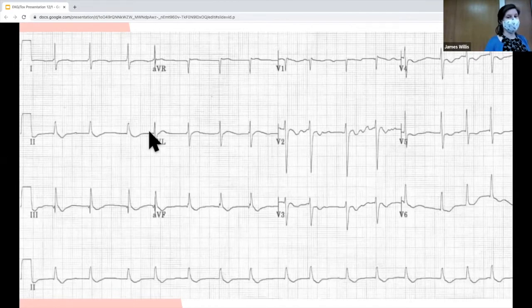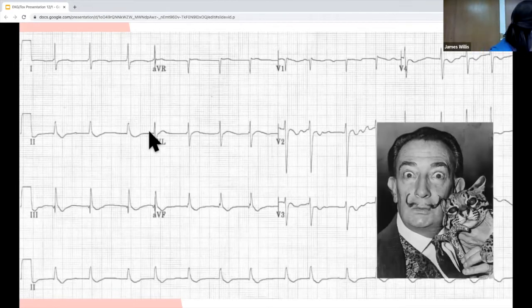Good. This is called digoxin effect. This is a person taking digoxin. So if you see this EKG, it looks like not normal. But this person is just on digoxin. These are the characteristics of someone who takes digoxin and the things that digoxin causes at baseline.